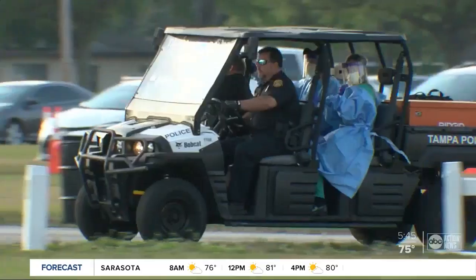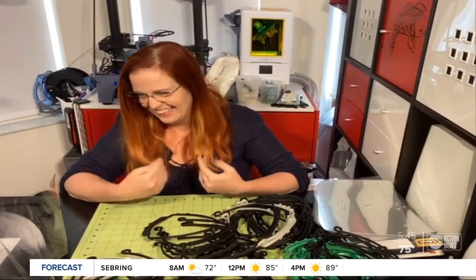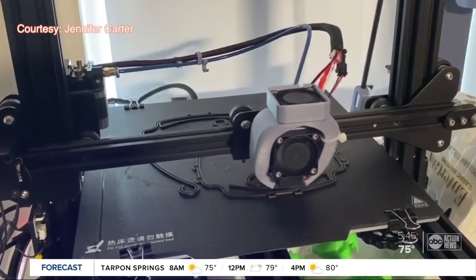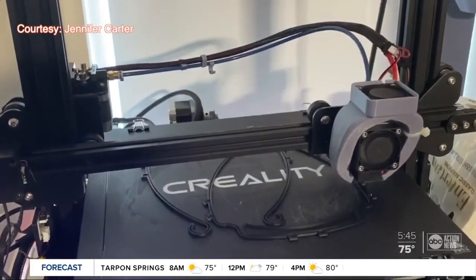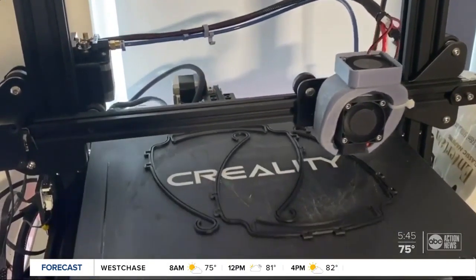So many people coming together to protect the health care workers who are protecting us. I get a little choked up. It's just the best of humanity coming out. With the demand increasing rapidly across Tampa Bay, the group is asking for anyone with a 3D printer or acrylic cutters for help.